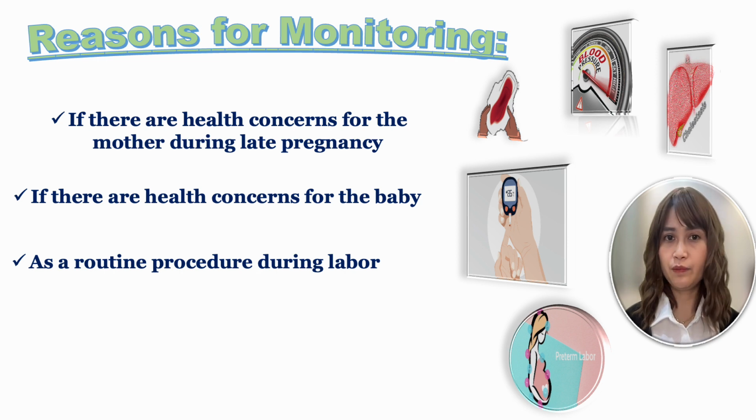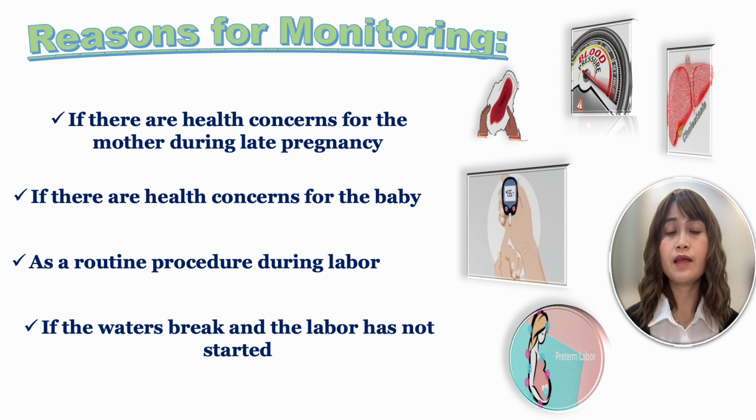Also, as a routine procedure during labor, some delivery suites have a policy to perform a routine 20-minute recording of the baby's heart rate when the woman arrives in labor. Next, if the waters break and the labor has not started. If the woman is waiting for her labor to start with ruptured membranes, the caregiver may perform a 20-minute trace to check her baby's well being.